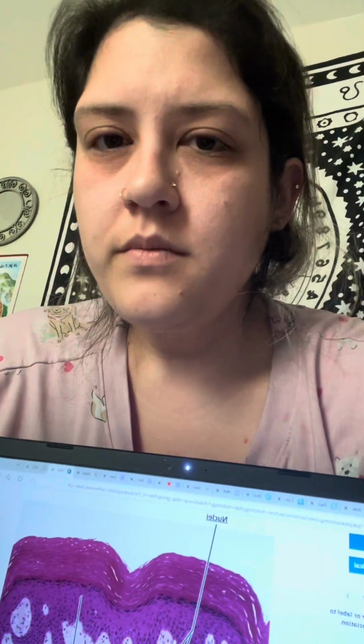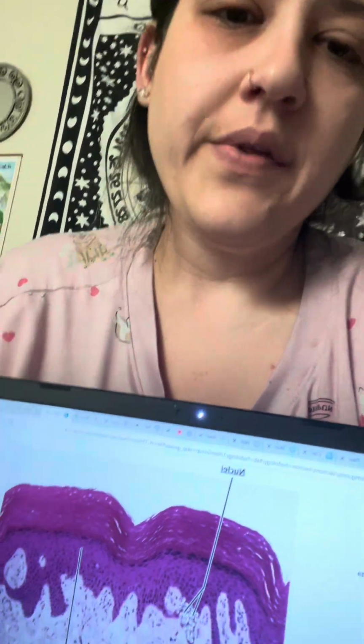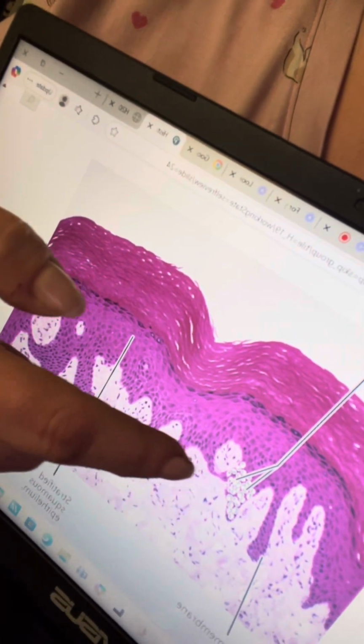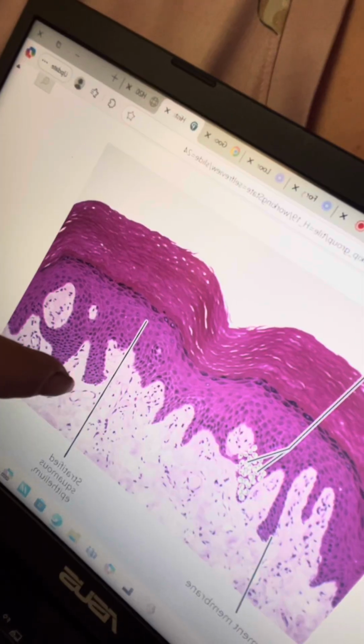And we know that nuclei are predominant in active keratinocytes. But like I said, as they mature, they go up to the surface and lose their nuclei, and they essentially start dying. They slough off. Eventually we shed our skin. So that's the process of the nuclei, which we can see in this basal layer. And the process is crucial.